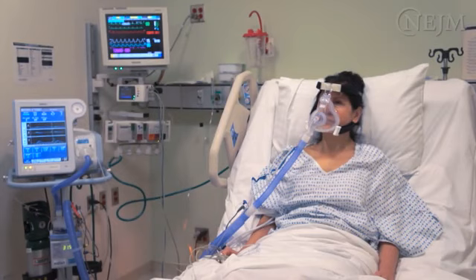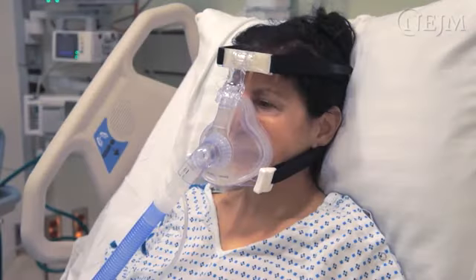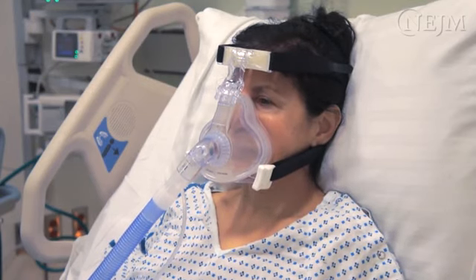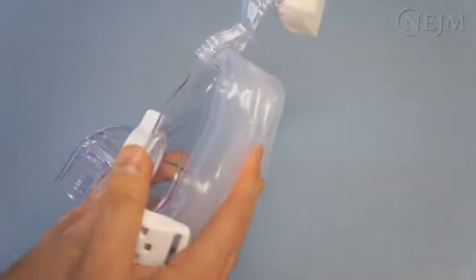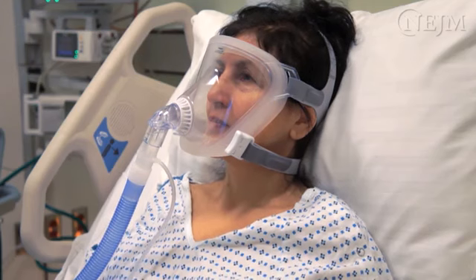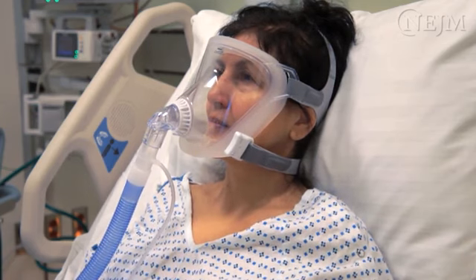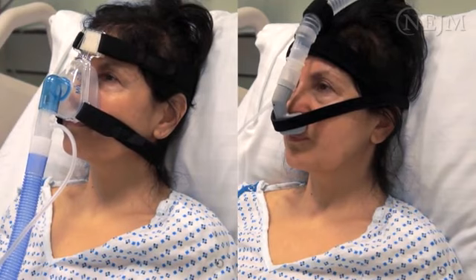The defining feature of BPAP and CPAP is the interface between the patient and ventilator that provides non-invasive airway access. In most cases, this interface is a mask. In urgent care situations, the oronasal mask is most common. This mask has a silicone cushion that forms a seal around the nose and mouth, but if applied too tightly it can be uncomfortable and abrade the skin on the bridge of the nose. Alternatives include total face masks, nasal masks, and nasal pillows. The total face mask encompasses the entire face including the eyes — it does not abrade the nose, but some patients may find it claustrophobic. The nasal mask or nasal pillows generally cause less claustrophobia, but the mouth must remain closed to prevent air leak.